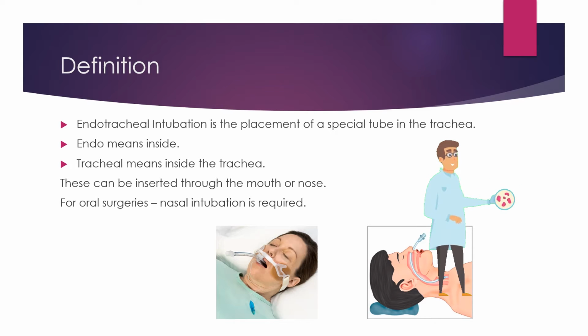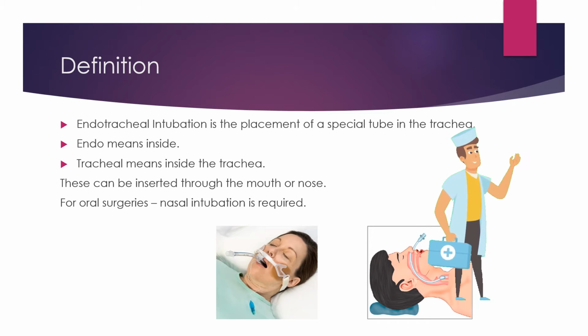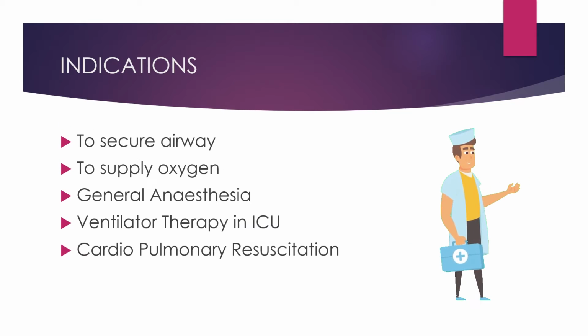Even in cases where a thyroidectomy and the like has to be done, there are times when the anesthetist might prefer using the nasal intubation. So that is about the types of endotracheal intubation. There is oral intubation and there is nasal intubation.